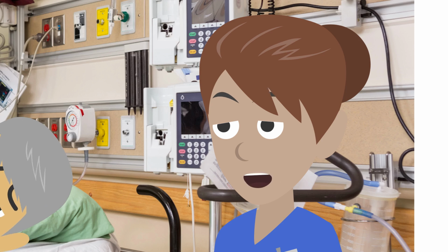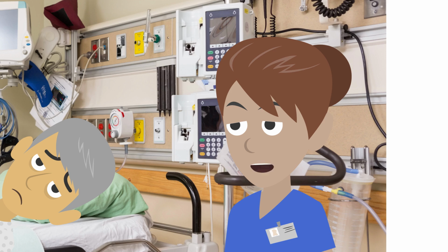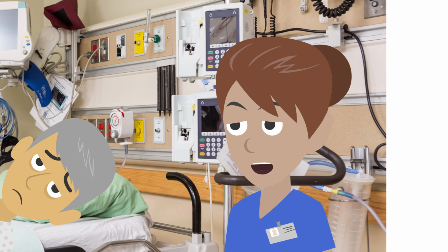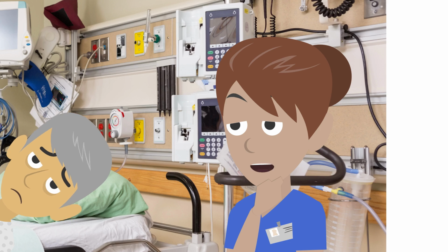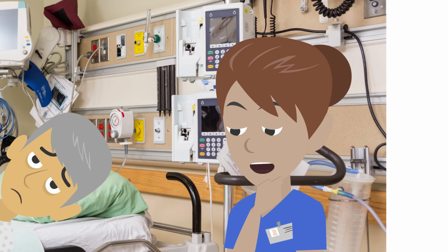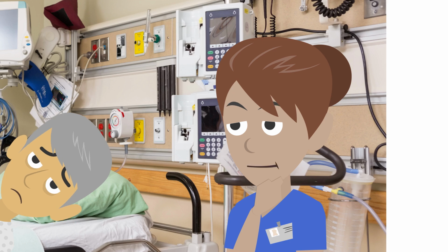I'll be feeding a narrow tube through your nose into your stomach. The tube will stay in place in your stomach while you are having the liquid feeds. Before I insert the tube, I'll measure the length of the tube that I need to insert. I do this by measuring the distance from the tip of your nose to your earlobe and adding the distance from your earlobe to the bottom of your breastbone. Then I'll add between 5 and 10 centimeters so the tube sits comfortably in your stomach. I'll put a measurement mark on the naso-gastric tube so I know how far to insert it.